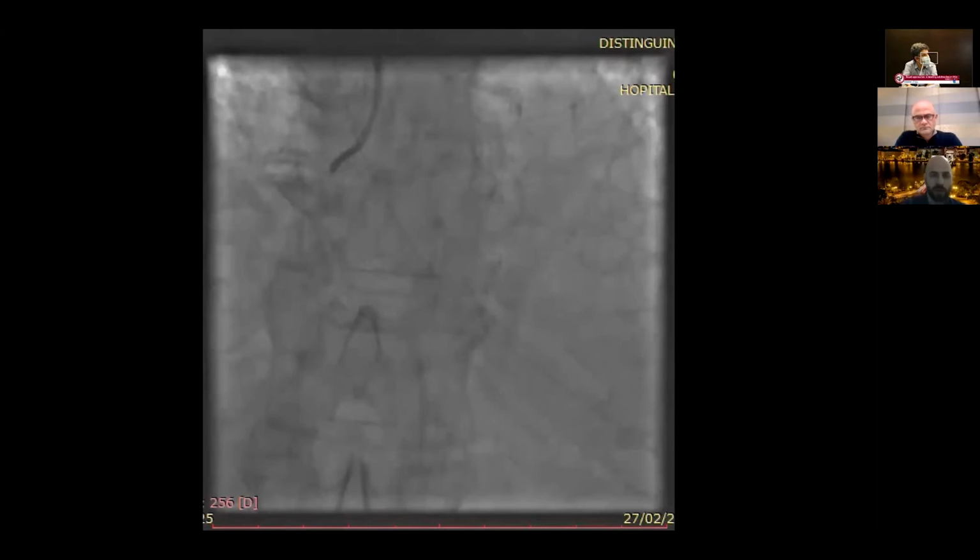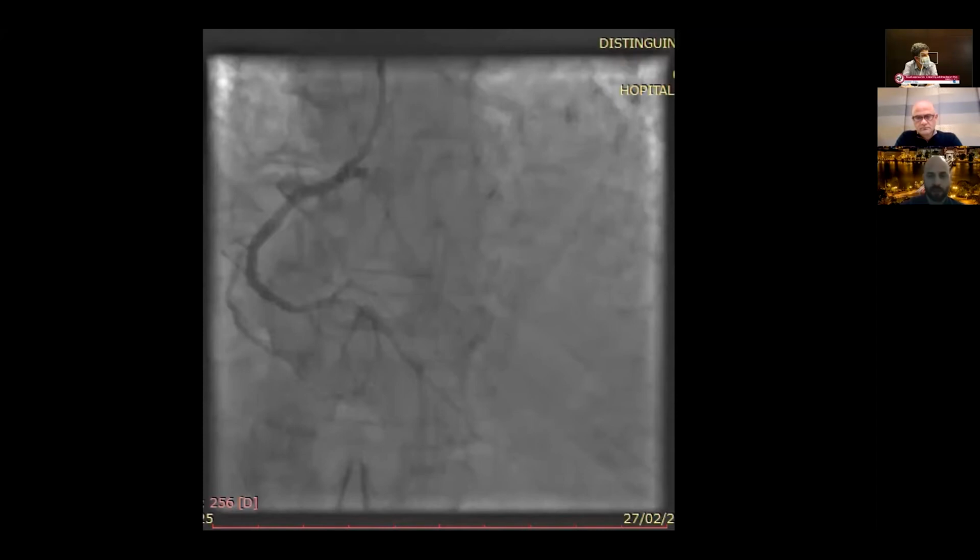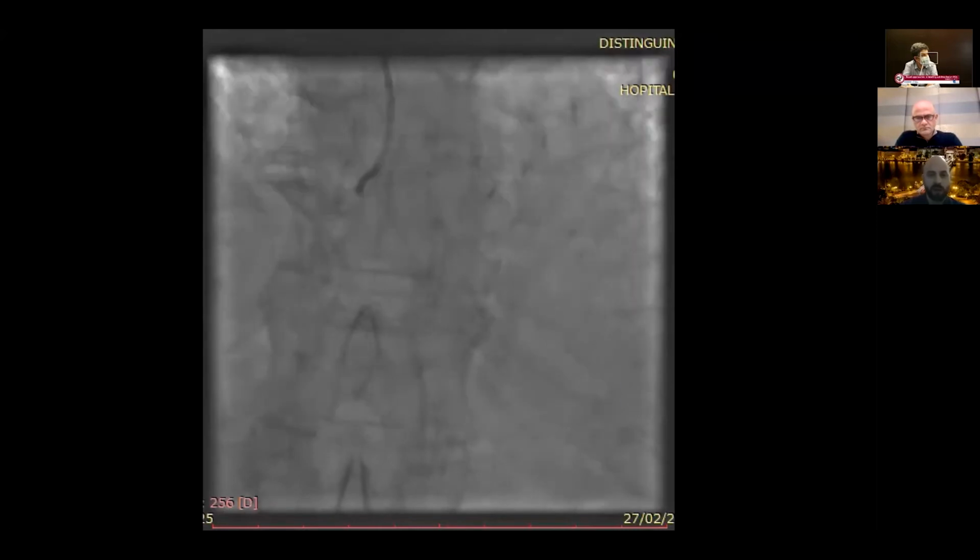This also has to do with the fact that in our cath lab, we do a lot of rotational atherectomy. I myself do a lot. We have lots of very good experiences. And as I said, as time was of the essence, it was mandatory to fix this RCA as fast as possible. I also agree with hemodynamic support.